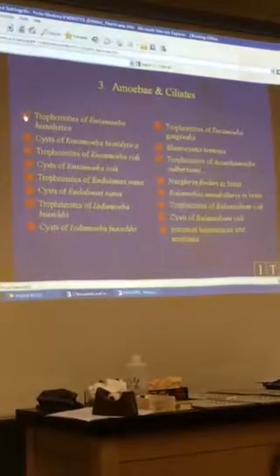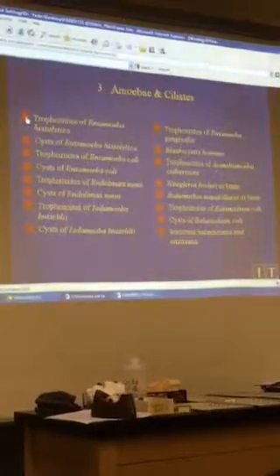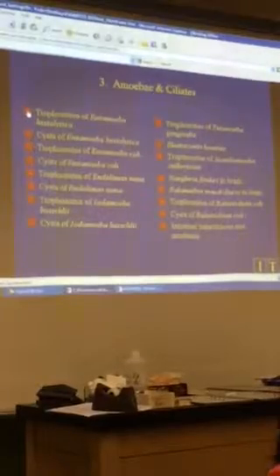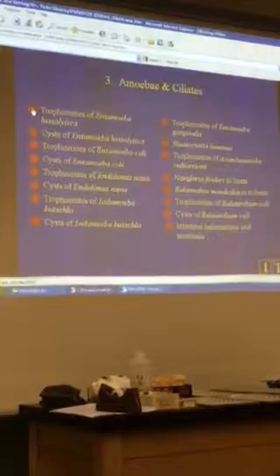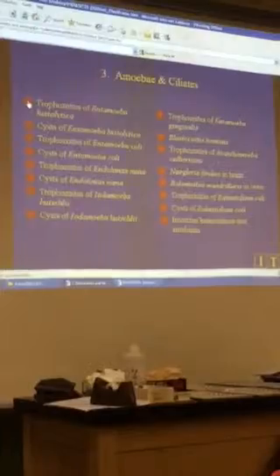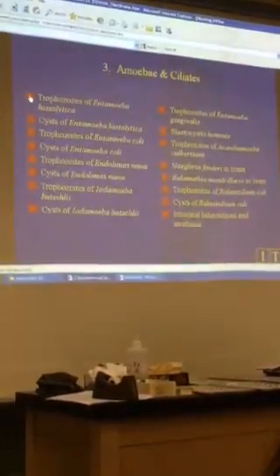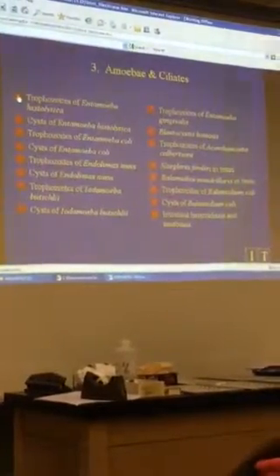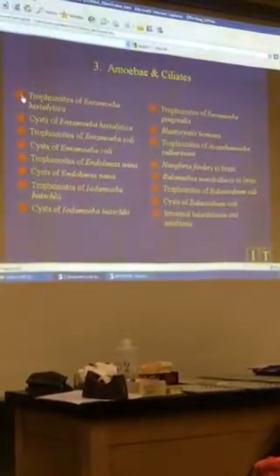Okay. I've been thinking about Giardia during class, and now I've got to switch my brain over to the amoebae. They're a little difficult to tell apart sometimes, especially E. histolytica and E. coli. Don't confuse E. coli with Escherichia coli. You always hear about E. coli on the news, on TV, and in microbiology. That's a bacterium. This is Entamoeba coli. In fact, I shouldn't even abbreviate it, because that's Entamoeba coli. It's non-pathogenic, but it looks an awful lot like Entamoeba histolytica. There'll be some ways to tell them apart, though.